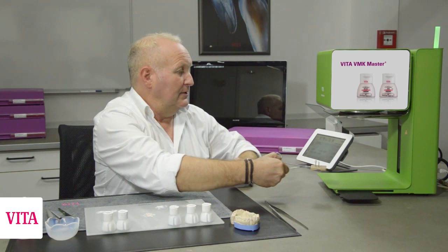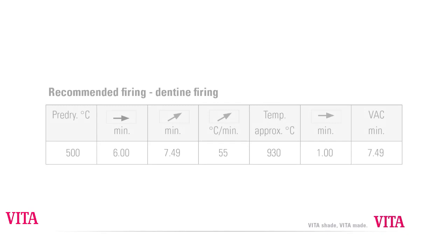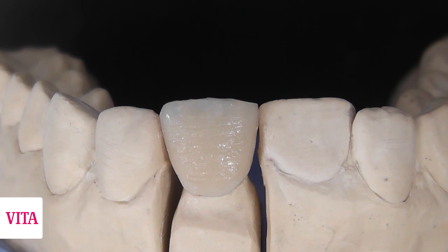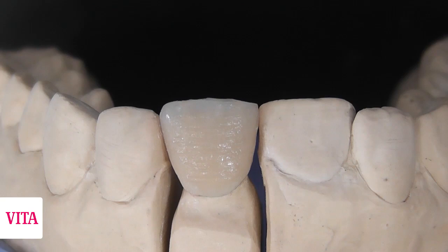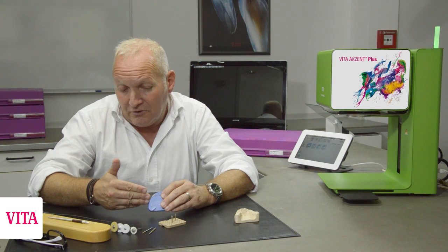First firing. Do a short control to confirm the right temperature, then press the start button. After the first firing, you can see all the surface textures we built up with the brush before firing are still visible afterward. VMK Master's low shrinkage rate enables us to bake crowns in only one bake. Even the approximate contact areas are perfect. The only thing remaining is fixing or adjusting the surface, which I do with a diamond-shaped flame instrument.